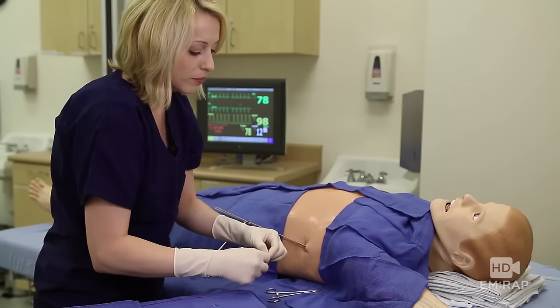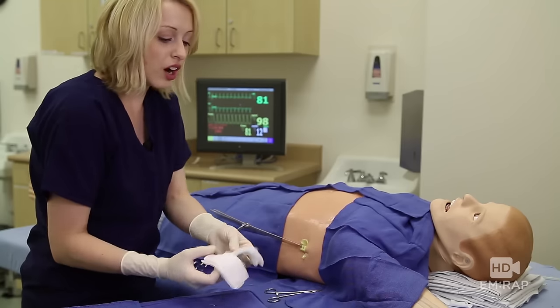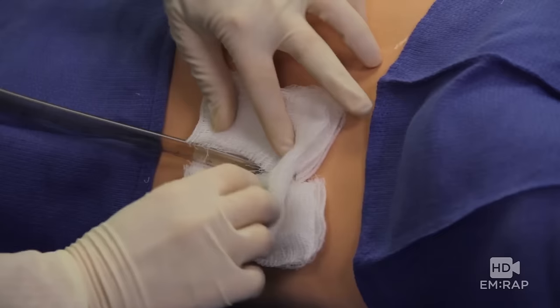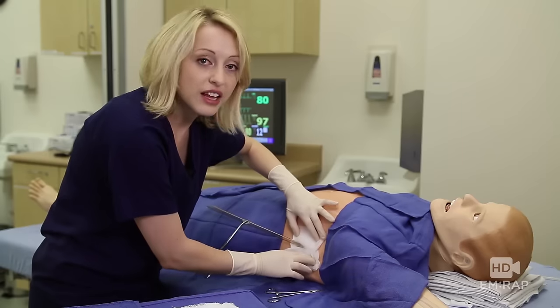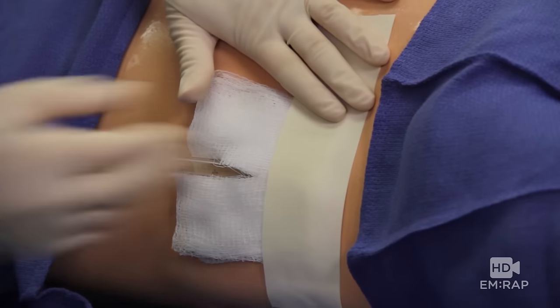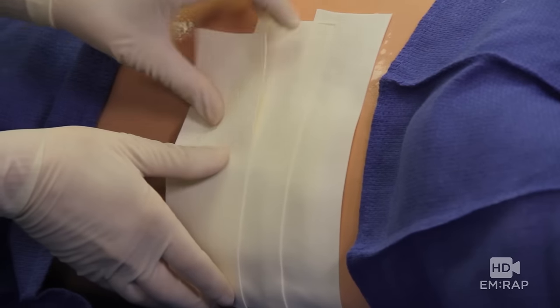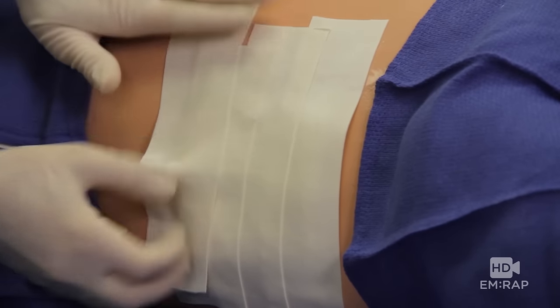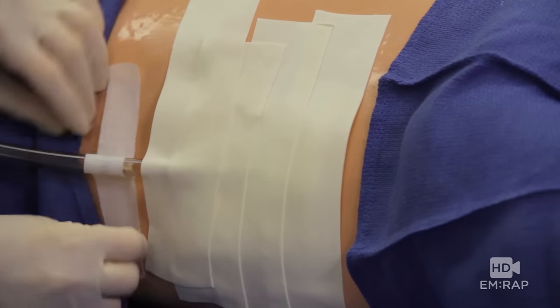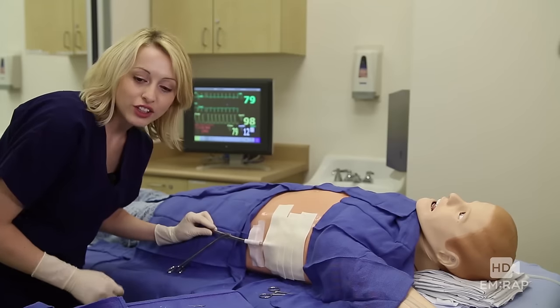First apply zero-form, then use gauze that you've pre-cut out. Now tape it in place and pinch the tape around the tube.